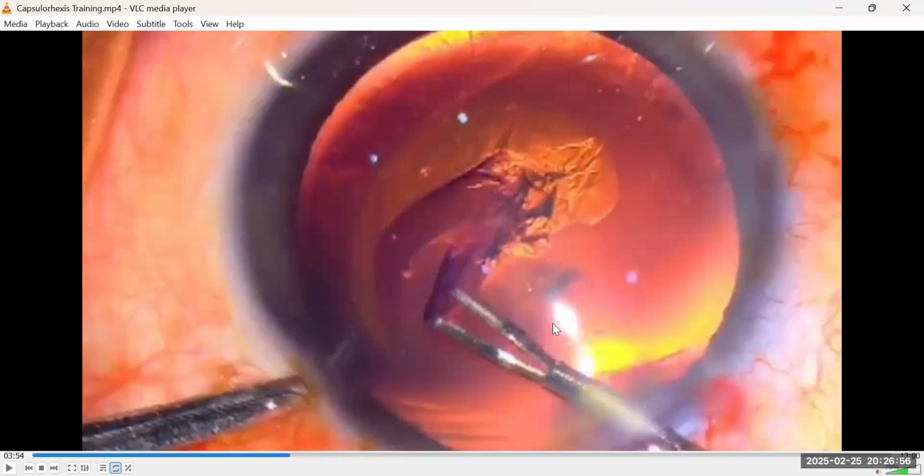All right, so the difficult areas, because this is projected some millimeters into the stroma before entering into the intracameral space, this has already given you an edge that is not at the limbus. So you cannot freely move your instrument in and out in any direction you want. That also means to pick a flap at 1 o'clock position here and pick a flap at 2 o'clock position here will be difficult.